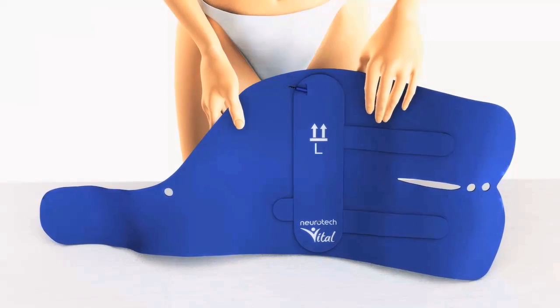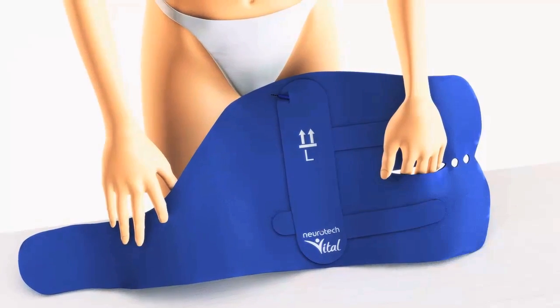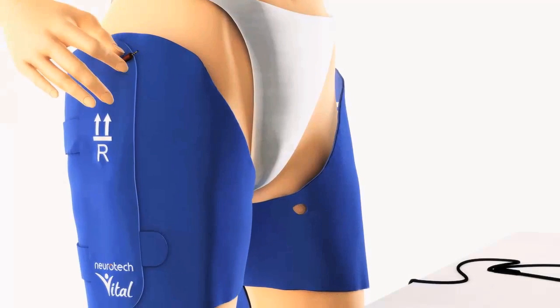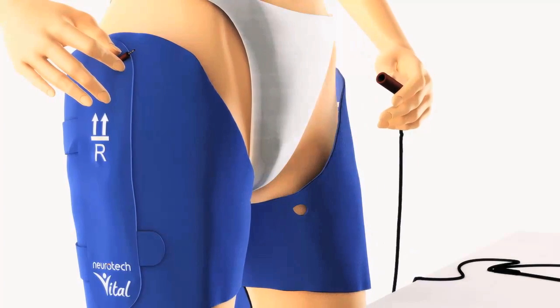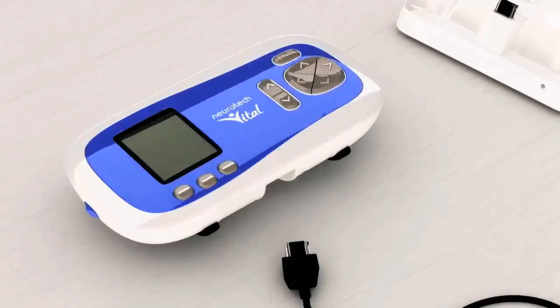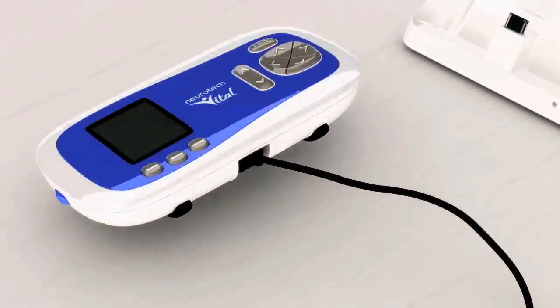Now put on the left thigh garment. This time put your left hand in the slit and your right index finger in the small hole. Once you've put on both thigh garments, plug the coloured terminals of the connecting cable into the sockets on the garment, taking care to match up the colours. Then plug the main connector into the Neurotech Vital controller.